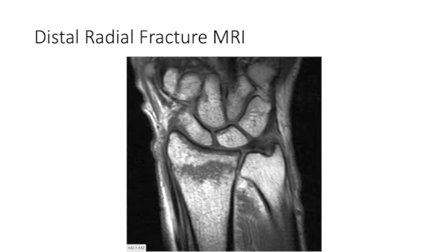This is a distal radius fracture on MRI. Obviously, the area of darkening is going to be the area that we have the fracture located in. So you can already see the limitations here of using MRI to diagnose fracture. Honestly, it takes a long time. That patient's going to be in that MRI machine for 45 minutes to an hour. It's going to be very expensive. And we can't tell the direction of displacement. All we can tell is that a fracture is there. So really and truly, for this mechanism of injury, MRI has some use if we really, really need it, but we're definitely going to use that plain film radiograph as the first line of defense.